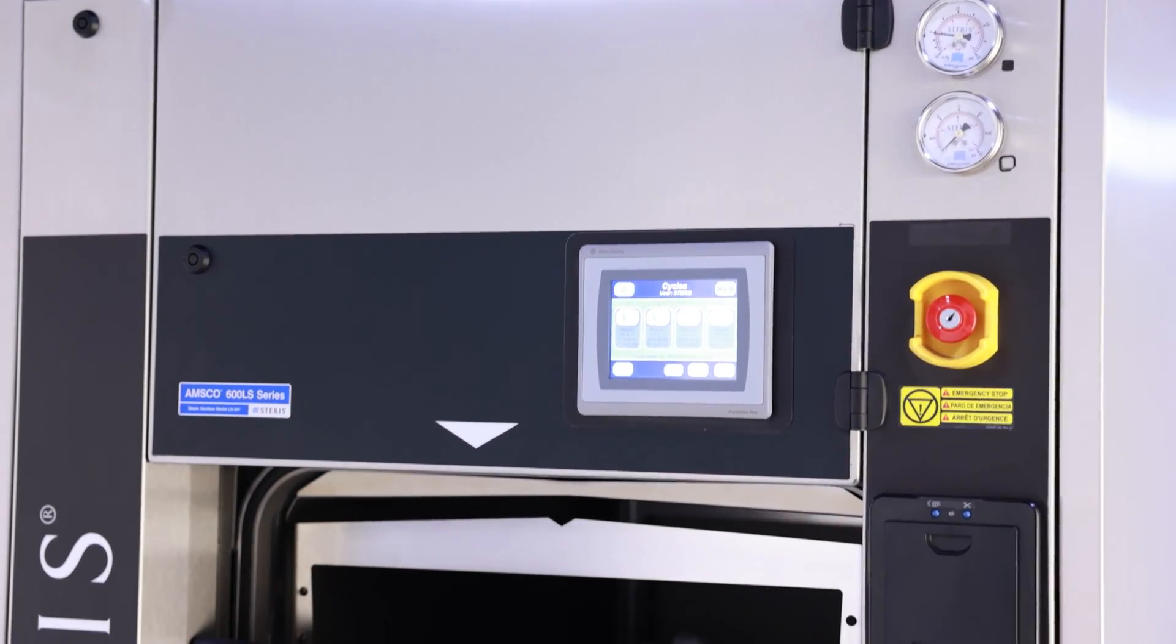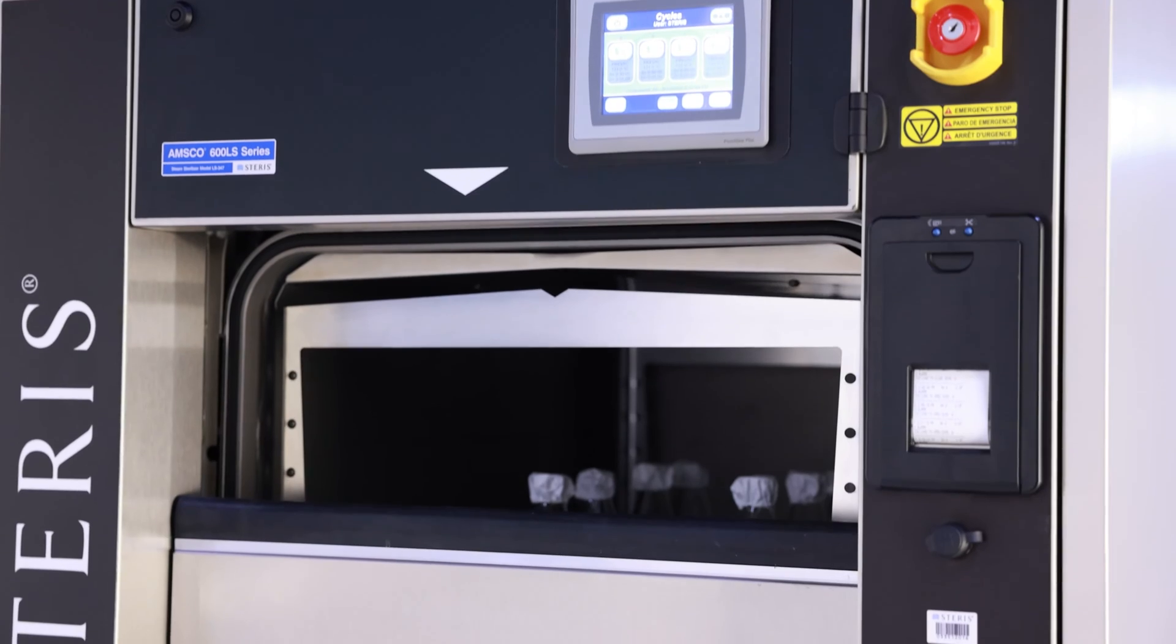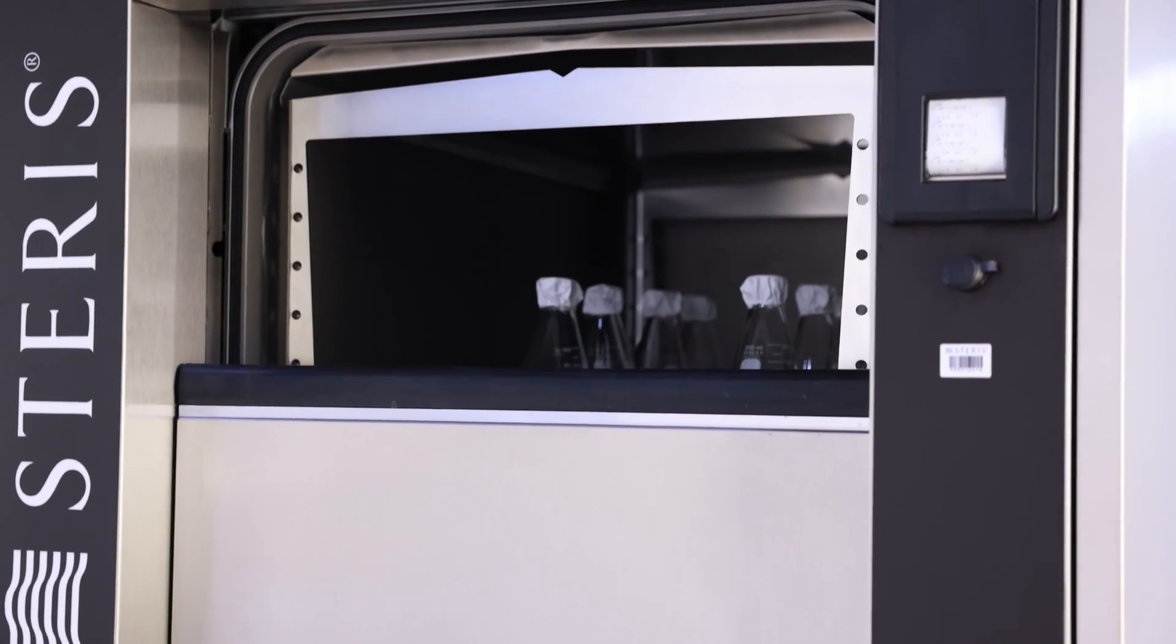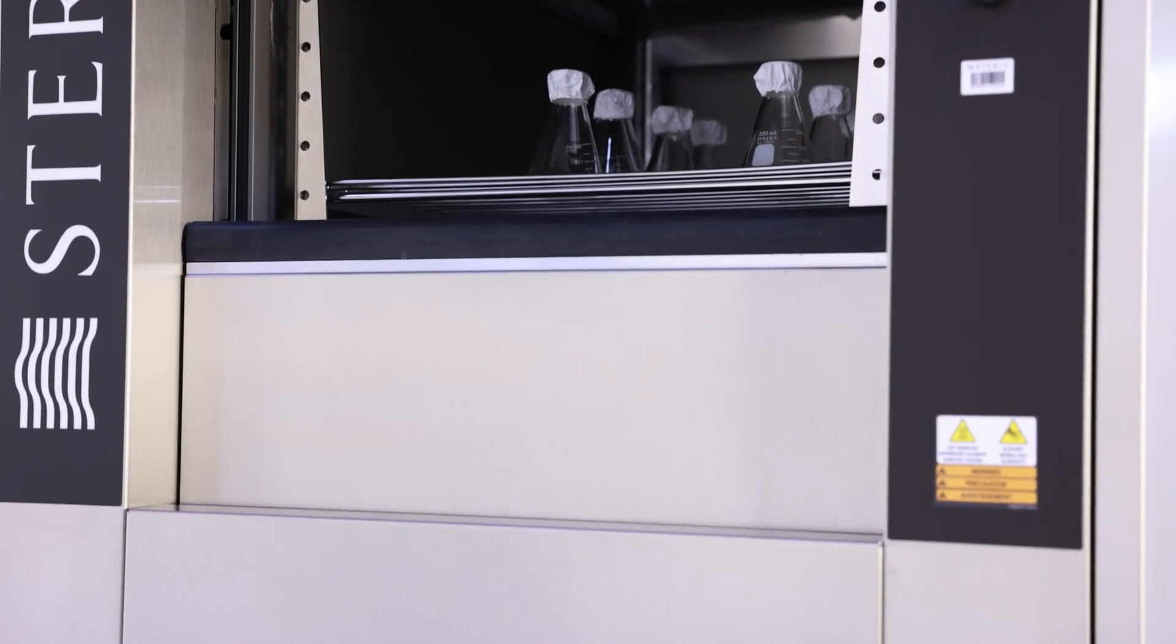The space-saving design of the AMSCO 600LS allows for easy loading and its sleek vertical doors eliminate the need for installation and service side clearance.